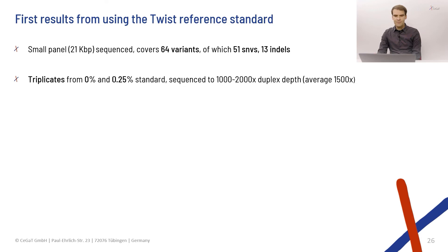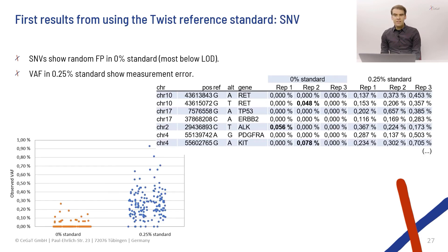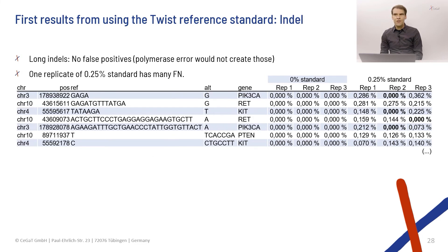Let's look at some data. For single nucleotide variants, in the 0% standard there are a few false positives, but they are at very low allele frequencies. In the 0.25% standard there is quite some noise — this is expected at these low allele frequencies with this coverage. Looking at indel variants, the longer indels show no false positives, which makes sense because such an error does not appear at random.